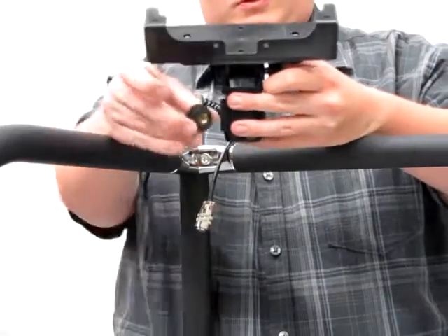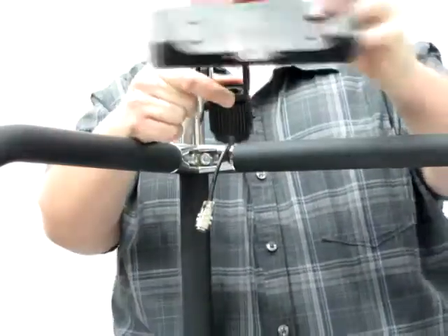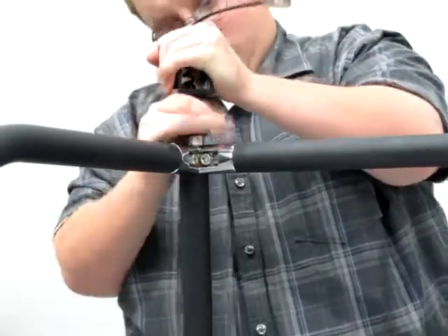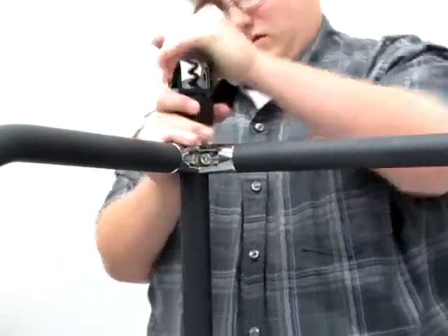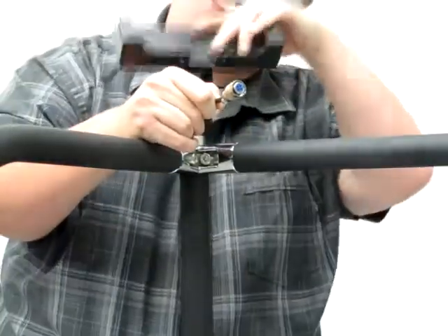Next, the indicator holder needs to be attached to the column. Do this by first taking the indicator holder apart into two pieces by unscrewing the two parts. Then take the bottom part, feed the connection through, and fix it to the column by unscrewing and screwing it back in. Then fix the top part of the bracket onto the bottom by screwing the two parts together.